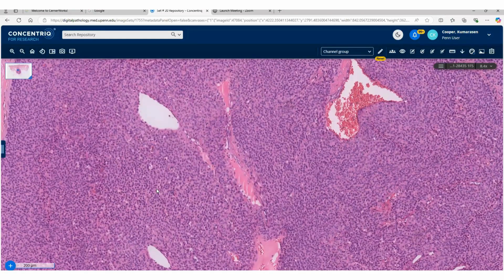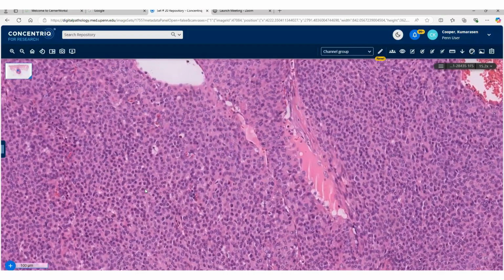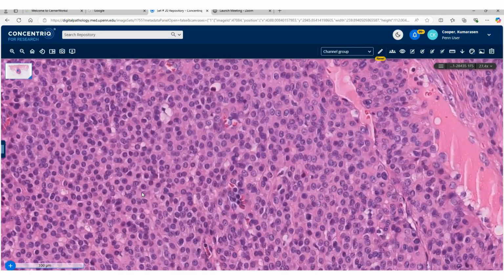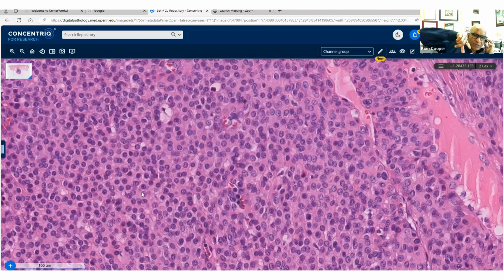Dr. Cooper, will you do BRAF on these? Because some of these, which may look atypical and infiltrative, could be malignant tumors. And it has been shown that some of these malignant glomus tumors can have BRAF. Okay, that's interesting. No, we did not. I don't think we had BRAF at that time. Okay. But also the glomus tumors, what's the molecular signature? Is it a notched? Notch. Yeah, notched.